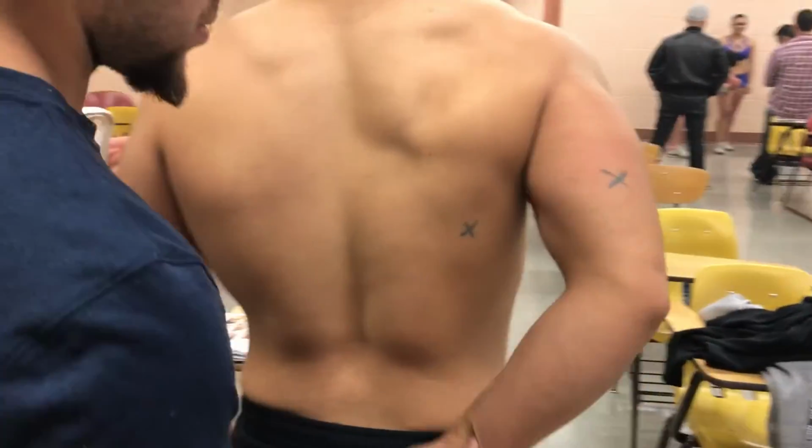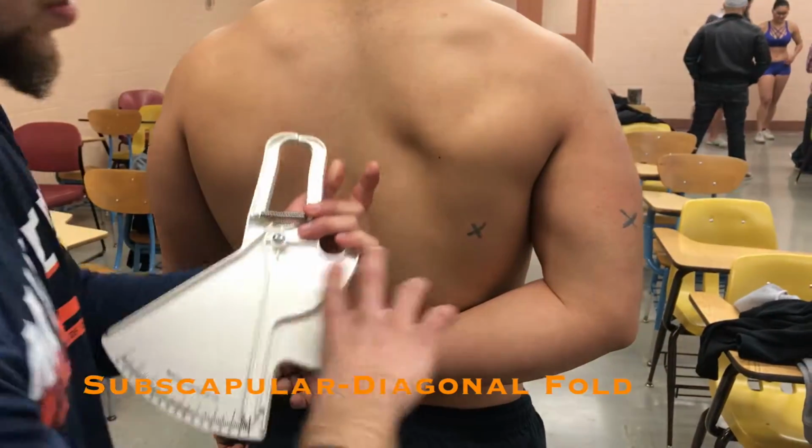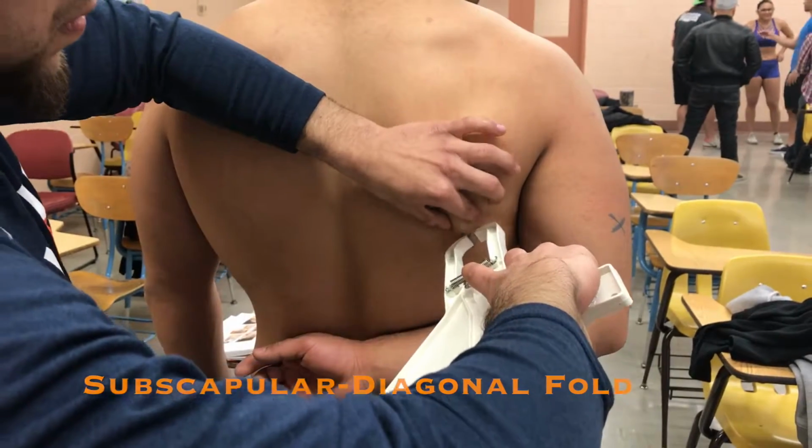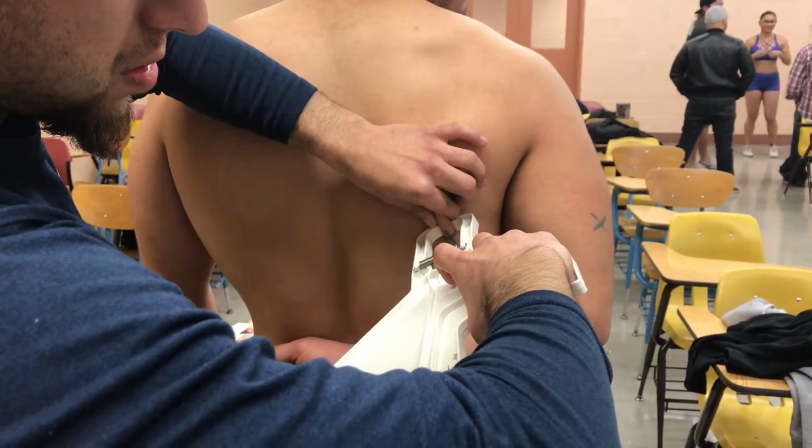Next, have the client put their arm behind their back in order to measure the subscapular site. Locate the inferior angle of the scapula. Mark the site 2 centimeters below, then pinch the site for 1 to 2 seconds and release once measurement has been obtained.